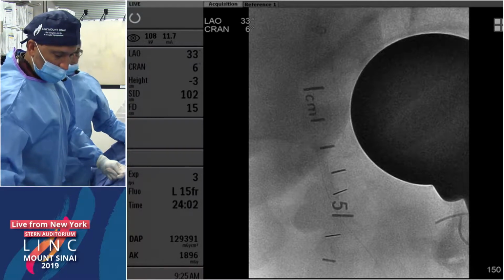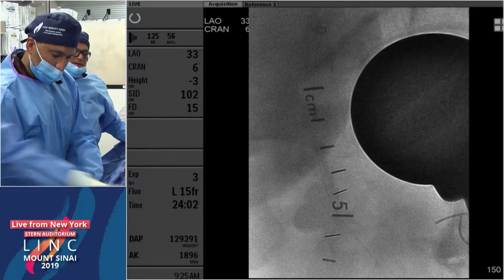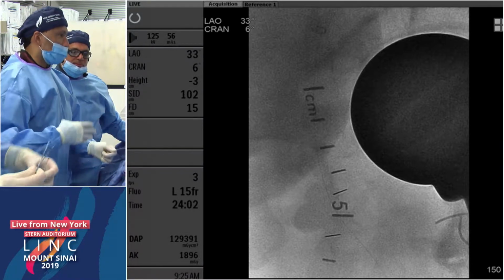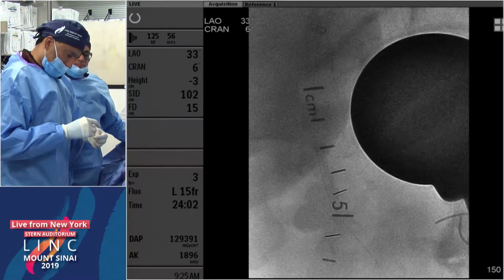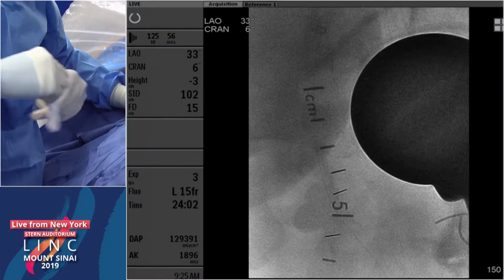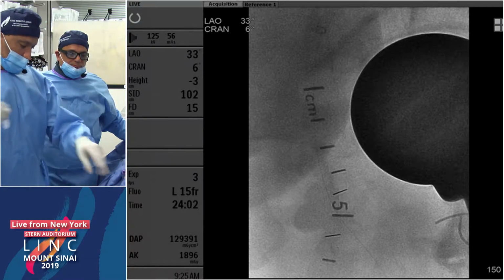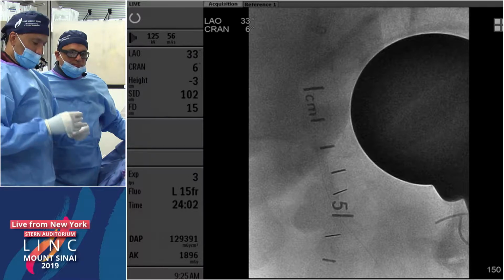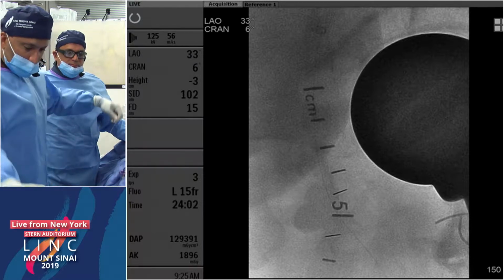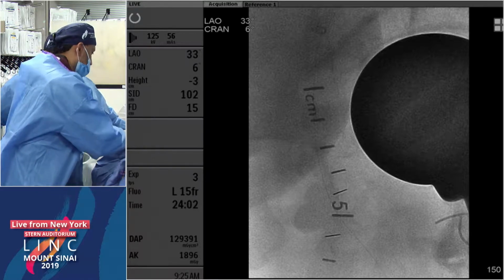But Dirk, just a counterpoint to that. If you can get away without placing a stent, why place a stent? Yeah, but what's the disadvantage? The procedure is more complex. You have the potential for distal embolization and so on. It's more costly, probably, and the long-term aspect of the recoil, since you can only remove part of the calcium, is still questionable. You showed a good short-term result on the other side, but it doesn't mean that this is durable. There's also no guarantee with a stent, but at least.